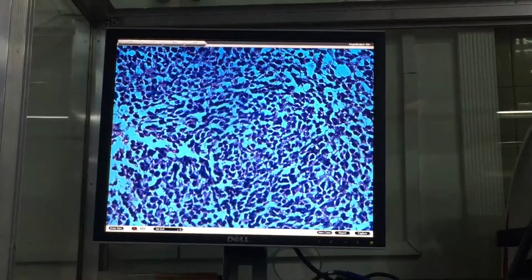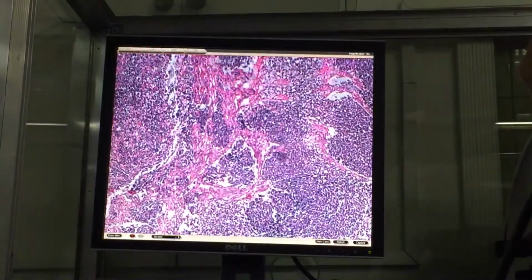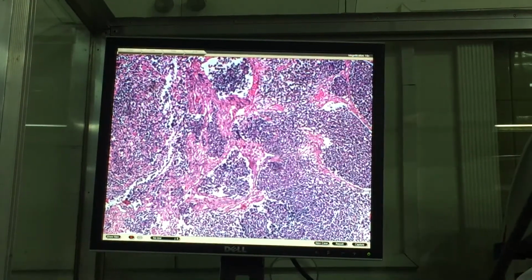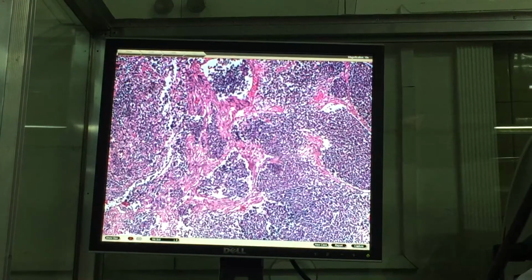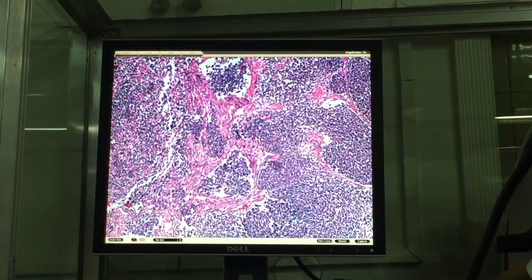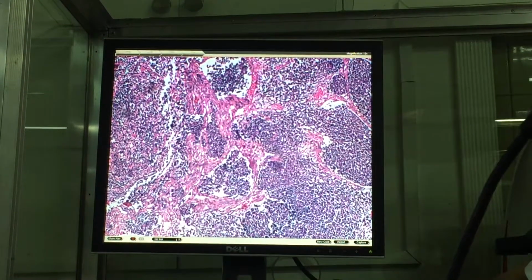Okay? And next component is your stromal tissues. Okay, your stromal tissues are the pink trabeculae. Okay, pink areas here. Okay, these areas, those pink areas. The pink areas here. Okay, so the stromal or spindle cells, which looks like fibrocytes or sometimes definite smooth muscle cells or skeletal muscle, okay, are seen.